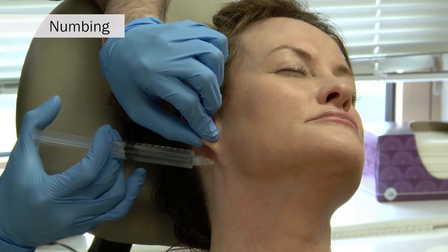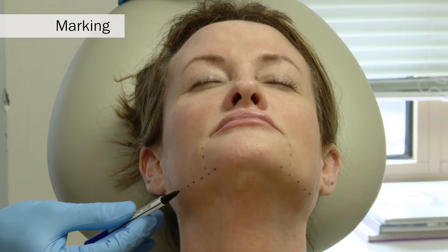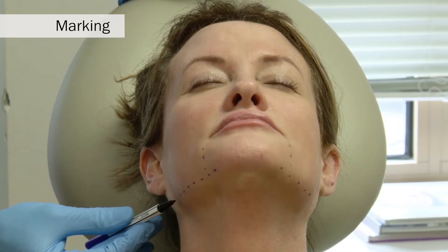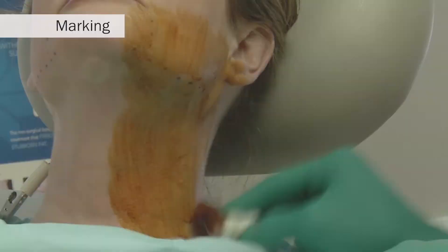Prior to starting the FaceTite procedure, a wheel of 1% lidocaine with epinephrine is raised under each ear and centrally. The mandibular border is marked, as well as the marionette lines. Additionally, a betadine solution is used to prep the neck for sterility.